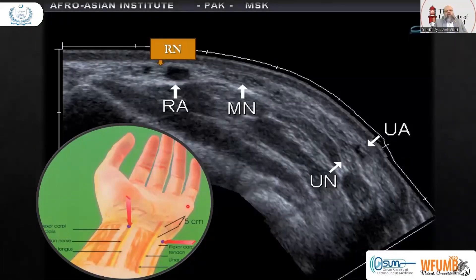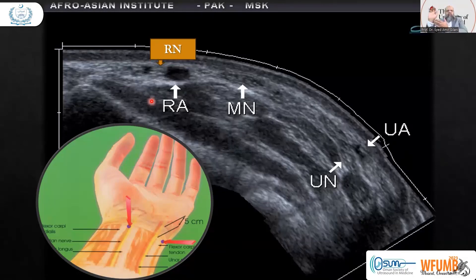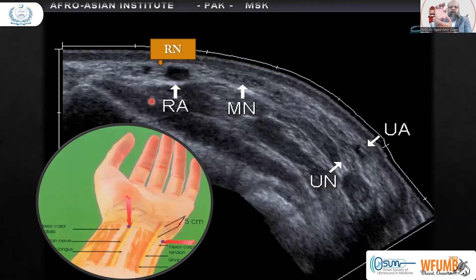Scanning the same nerves, we can see the ulnar artery and ulnar nerve, the median nerve in this panoramic view, and the radial artery and radial nerve. In the hand, on the radial side, along with the radial artery we find the radial nerve. The median nerve is in the middle and the ulnar nerve is on the ulnar side along with the ulnar artery. Here we have the longitudinal view of the ulnar nerve at the wrist, and a cut section.